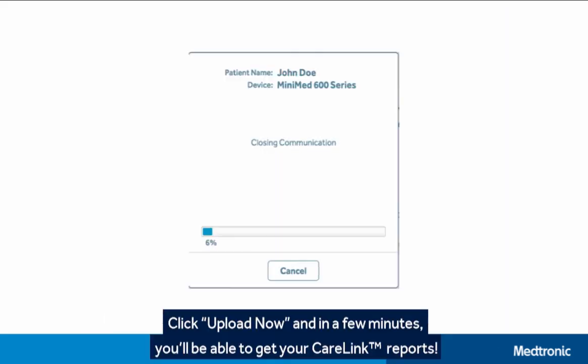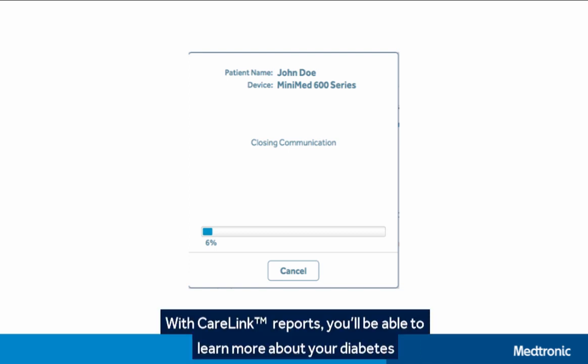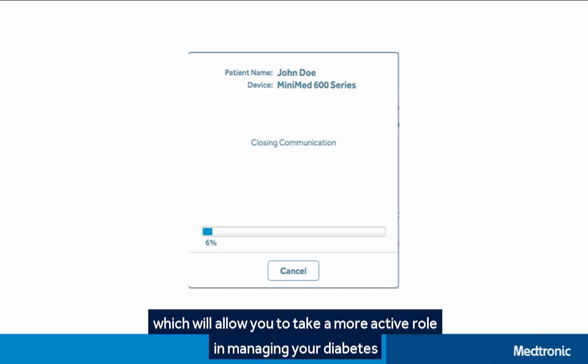After selecting the device that you want to upload, check to make sure your device is ready and click Upload Now to continue. In a few minutes, you'll be able to get your CareLink Reports and learn more about your diabetes, which will allow you to take a more active role in managing your diabetes.